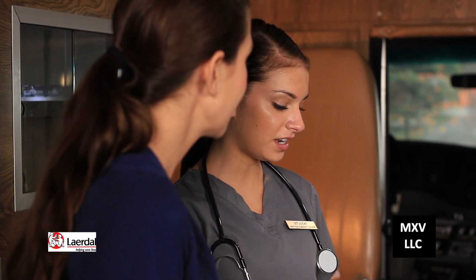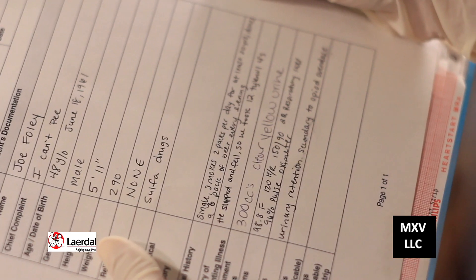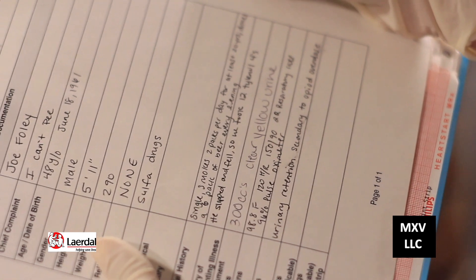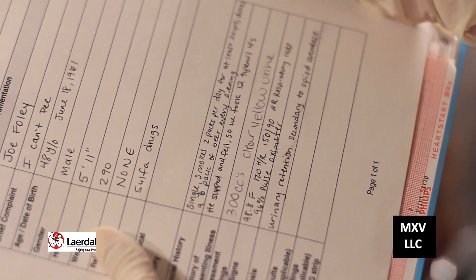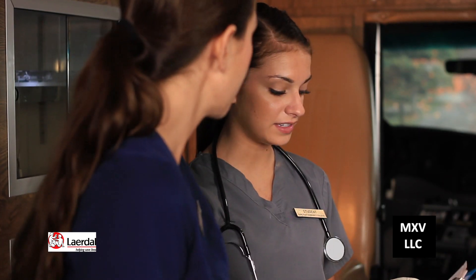In this scenario, we're going to demonstrate how to insert a Foley catheter on a male with urinary retention. Our patient today is Joe Foley. He is 48 years old. He slipped and fell, so he took 12 Tylenol 4s, and his complaint is that he cannot urinate.